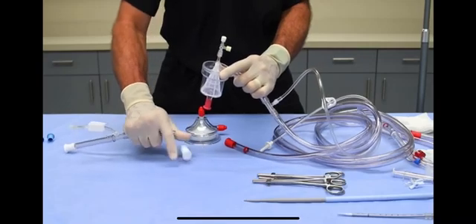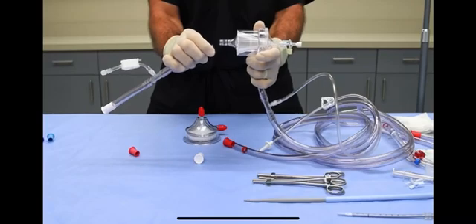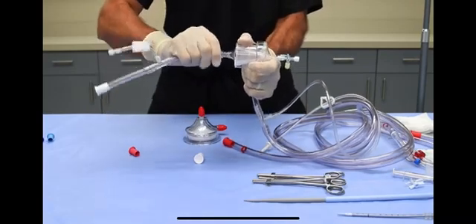Next, remove the white vented cap from the waste T-line connection and ensure the T connection faces opposite the inlet port of the bubble trap. Connect it to the outlet port of the bubble trap.